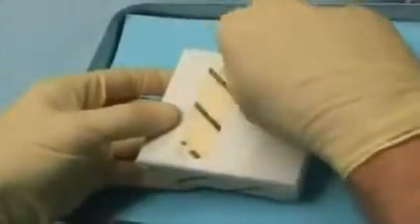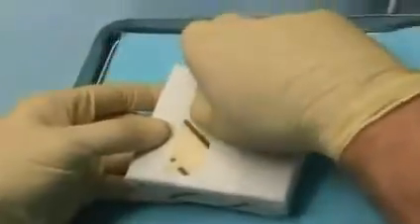Furthermore, it's very important to work with sterile instruments. Here you see a root canal treatment box wrapped to preserve its sterility. It's opened just prior to the root canal treatment, and the various instruments are neatly arranged.